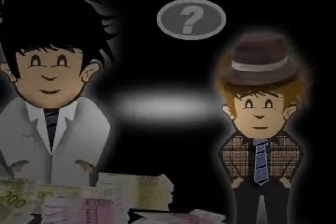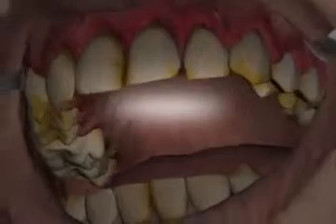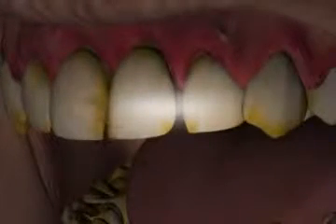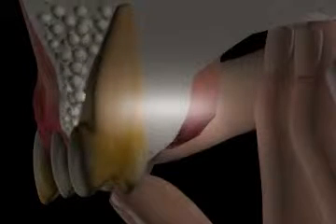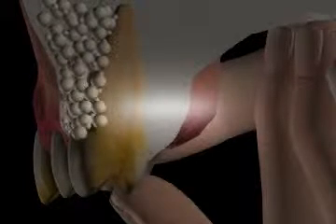Another problem around bone augmentation is that some patients still have some of their teeth or are experiencing horizontal bone loss, such as patients with periodontitis. For the bone to grow in, blood is required. Consider the case of a vertical bone pocket. Vertical meaning the bone is missing to a very limited degree. For example, only at one tooth, as shown in this animation. The bone defect consists of 5 sides, 4 of which are bone, and all of which are well supplied with blood, and therefore ideal for the growing in of bone substitute material.